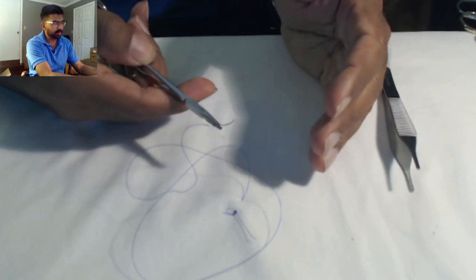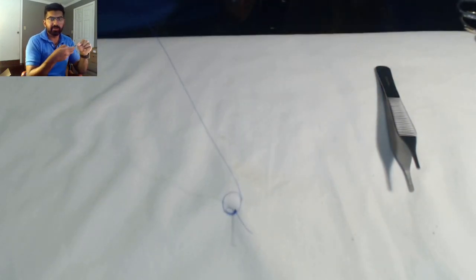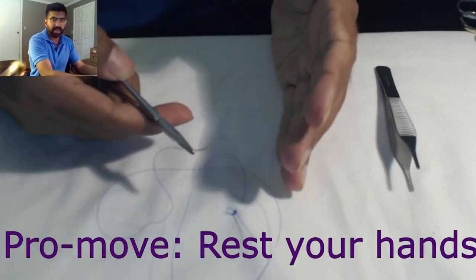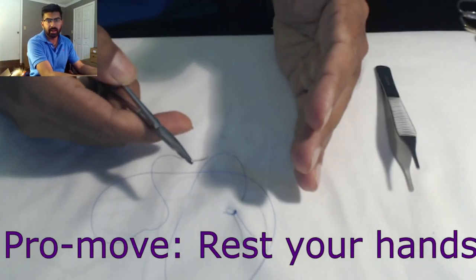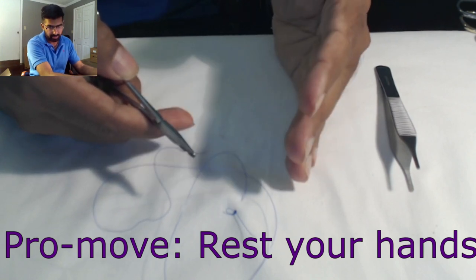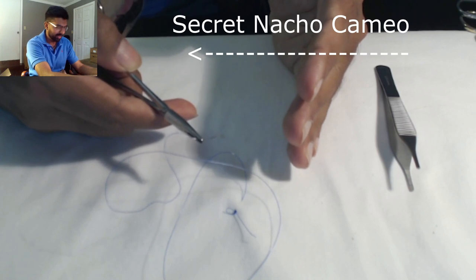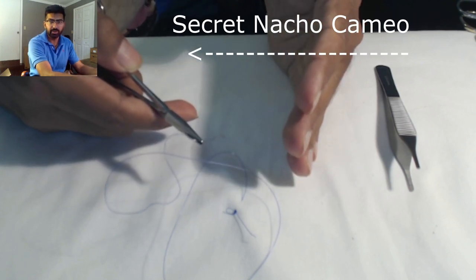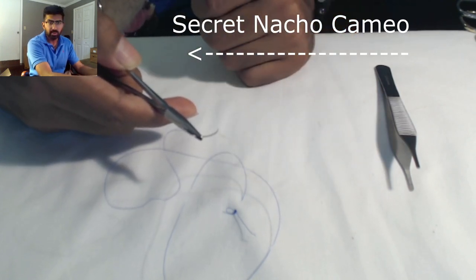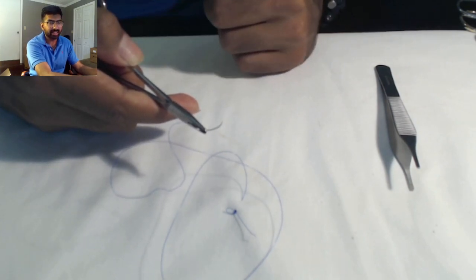The key thing most people don't talk about is that as I'm reloading, it's not floating in the middle of space. My hands are actually rested on either the patient, somebody else's hand, or the bed. This allows you to have a lot of stability as you reload the needle.